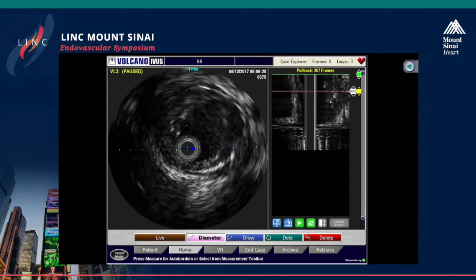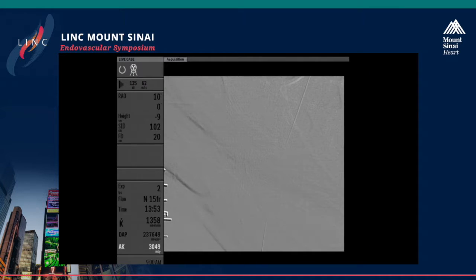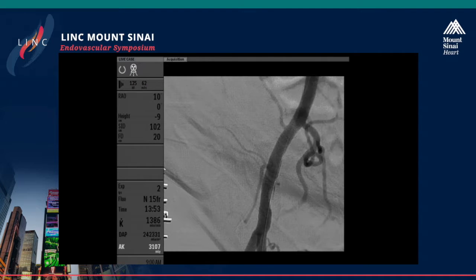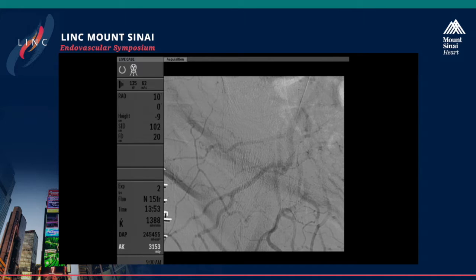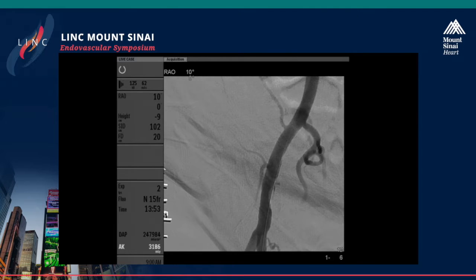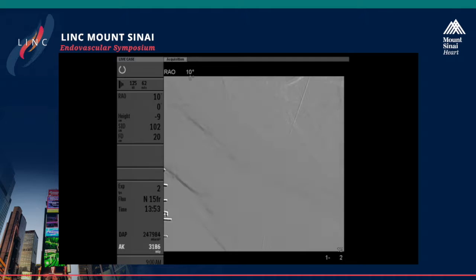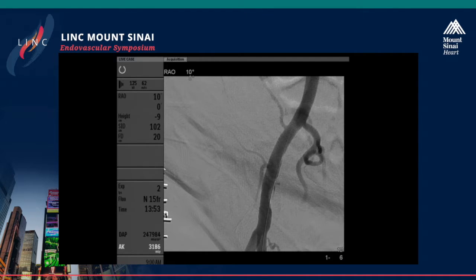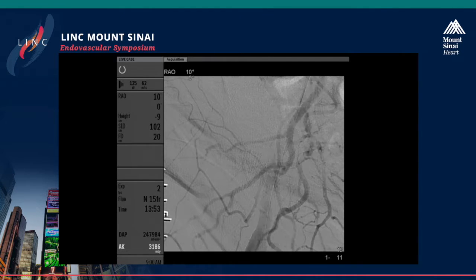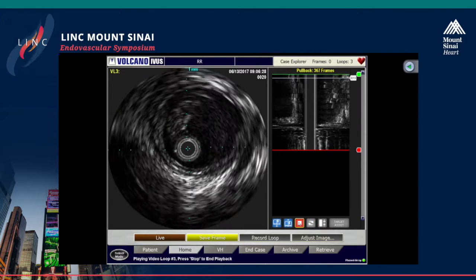Yes, so I think the approach with directional atherectomy to remove as much as possible makes a lot of sense. I think you probably managed to remove a large part, but certainly not everything, as we can clearly see in the IVUS. So now the question is really, if we go for drug delivery, is DCB the best option, or would a short drug-eluting stent be the better option because it could deliver a drug and at the same time provide an additional scaffolding? So maybe that's something for the panelists again to address. I'd say this looks pretty good, right?